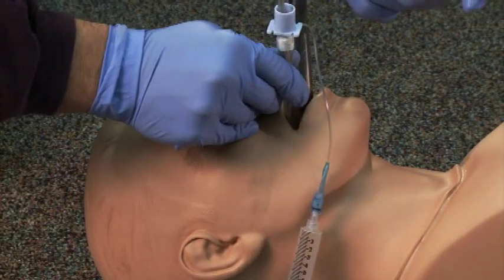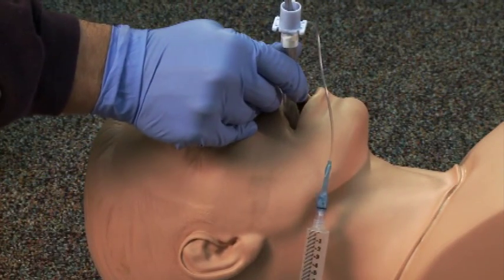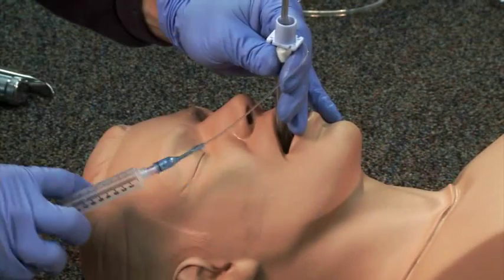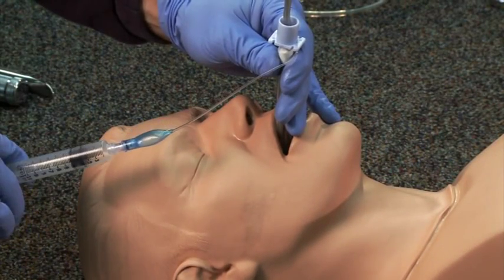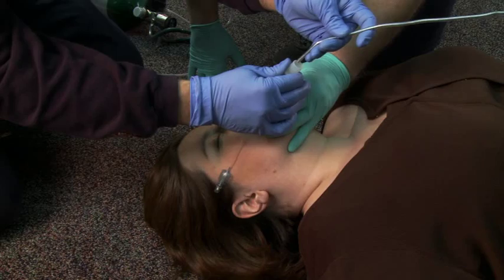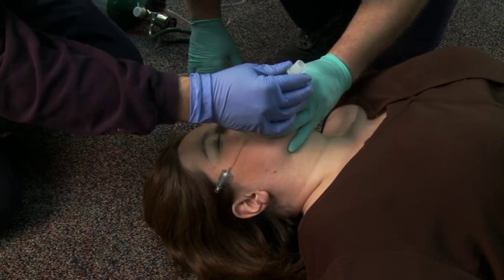Holding the tube in place, remove the laryngoscope blade, attach the syringe, and inflate the cuff with 5 to 10 cc's of air. Remove the stylet if used and attach a bag valve device.